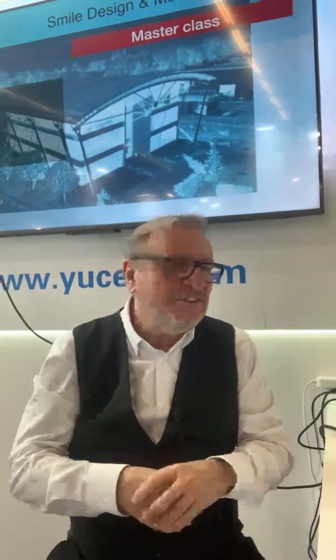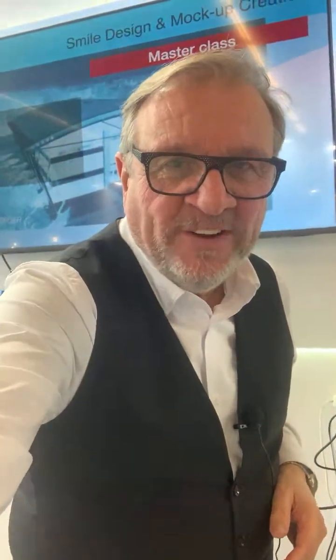In live for the final presentation about smile design and mock-up creation. So let's move a little to see the screen. Like that. Yes, it's better, yeah?